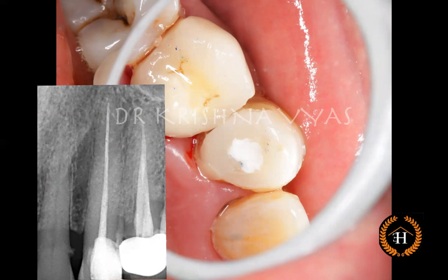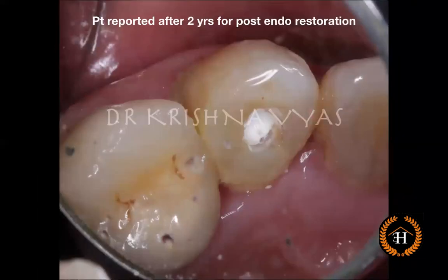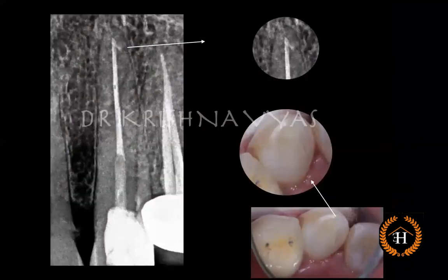This patient did not want to go for gingivectomy and post-endo core procedures, and then did not report for two years due to the COVID times. When he came back, the tooth was still saved because we had reinforced it with the pre-endo buildup. Otherwise, if it had been left with just a temporary restoration, the tooth would have fractured or there would have been leakage. After two years, the post-endo core was done and the core buildup was completed with direct composite.